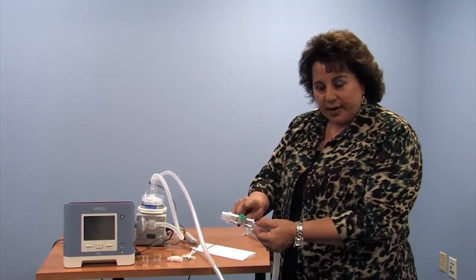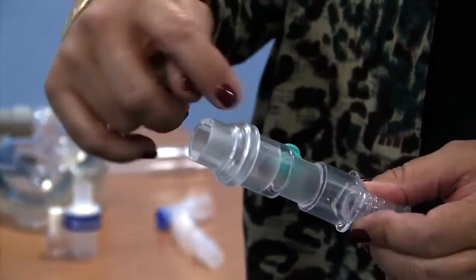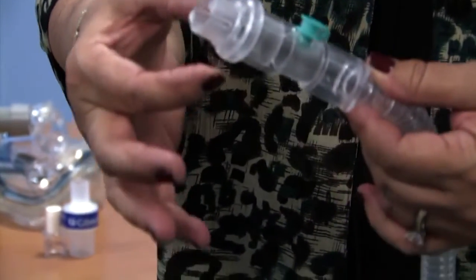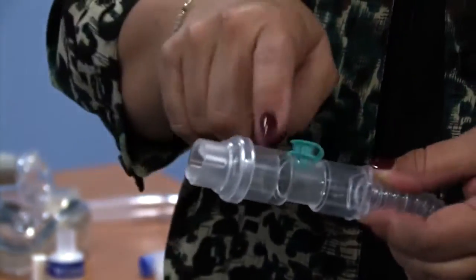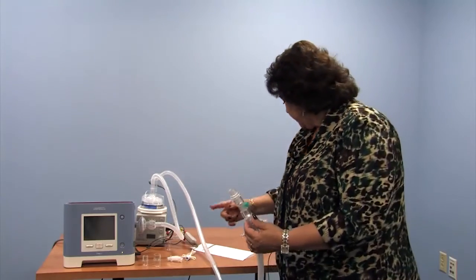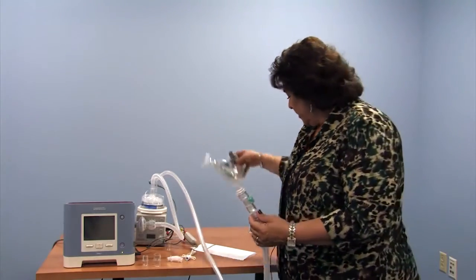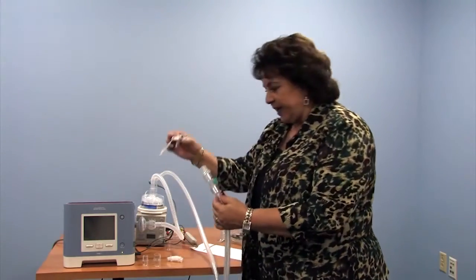This is a place for a humidifier temperature probe, and this is the proprietary, what they call exhalation port or whisper swivel. This is where air or exhalation gas comes out. So what do we do with this? We can hook this to our mask. We can hook this to our tracheostomy tube.